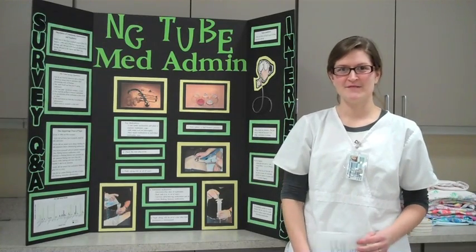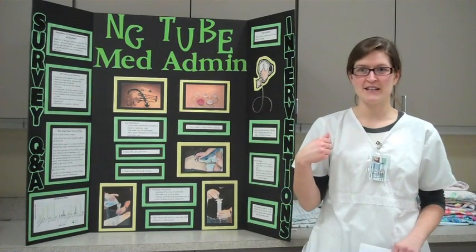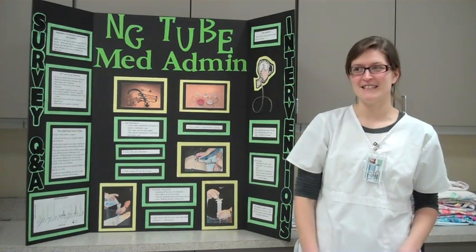An NG tube is a flexible plastic tube that goes in through the patient's nose, down the nasopharynx, through the esophagus, and into the stomach.